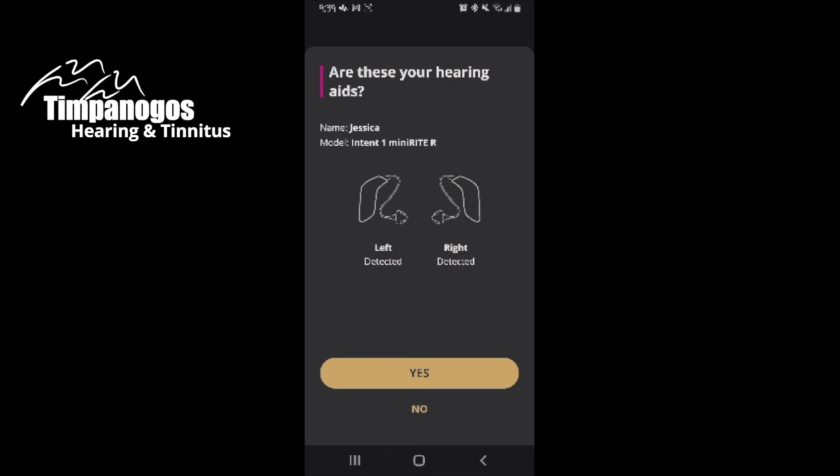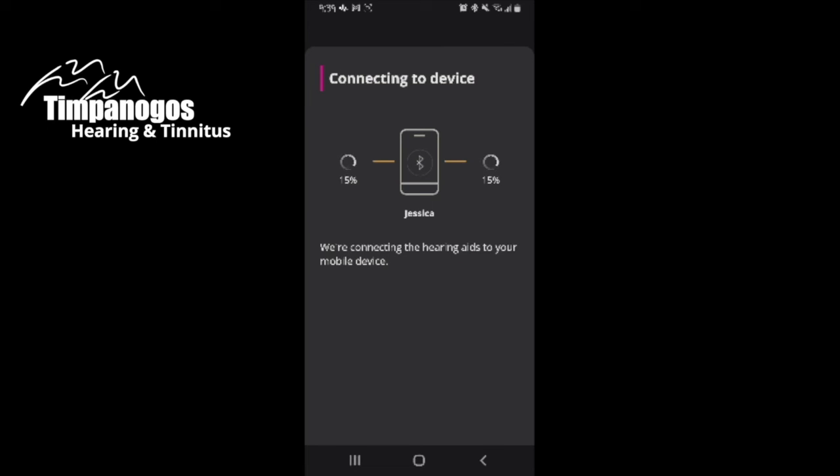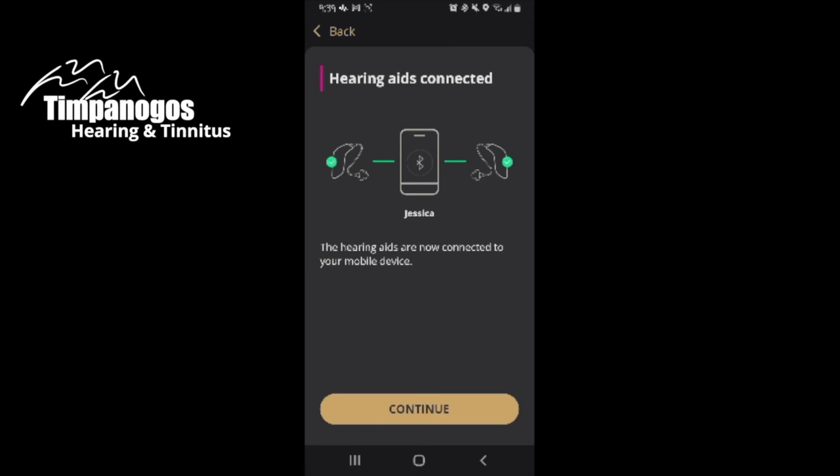Now the app is searching for my hearing aids. It found them — yes, this is them. And now it's pairing them to the app. Go ahead and hit Continue.